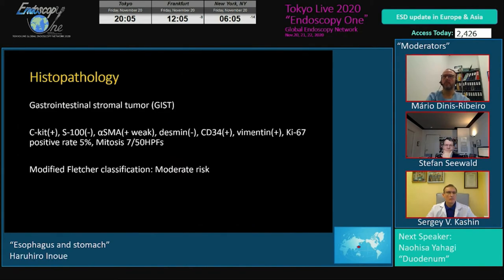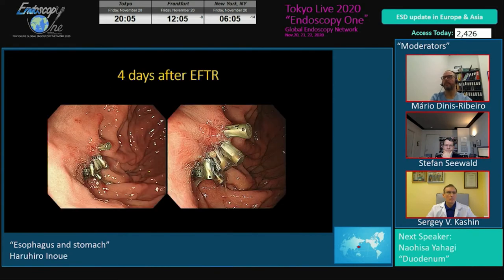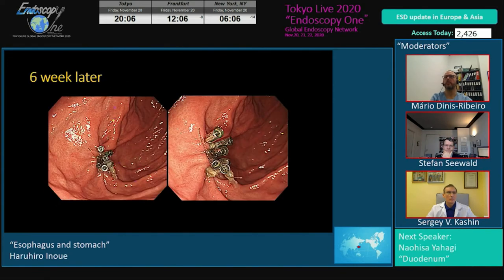This is a GIST tumor, moderate risk. 4 days after procedure, 1.5 months later.